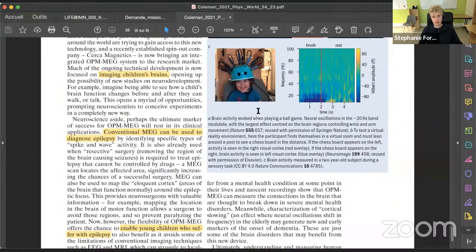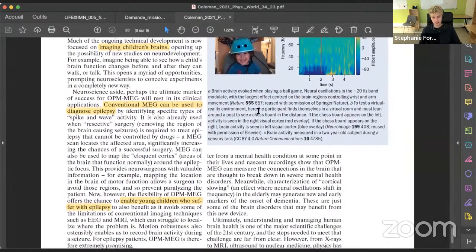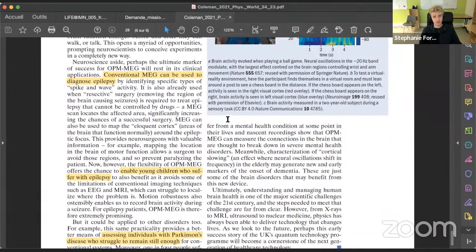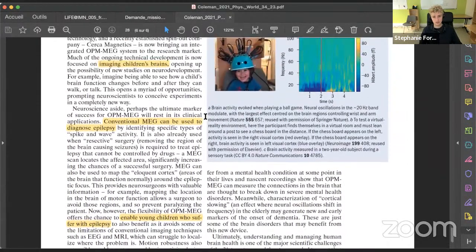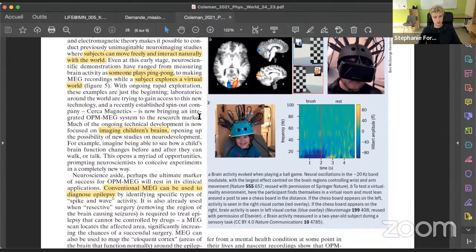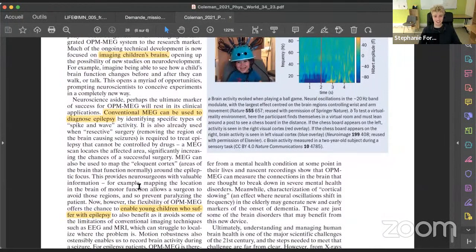And the fact that it can be used on any type of brain size is also a very big plus. So I think they are mostly interested in studying children and the developmental evolution of the brain at the functional level. But as I said, they're also interested in epilepsy, especially epilepsy in young children. That's what they are focusing on, and it's something very interesting and still hard to study with the technology we had.